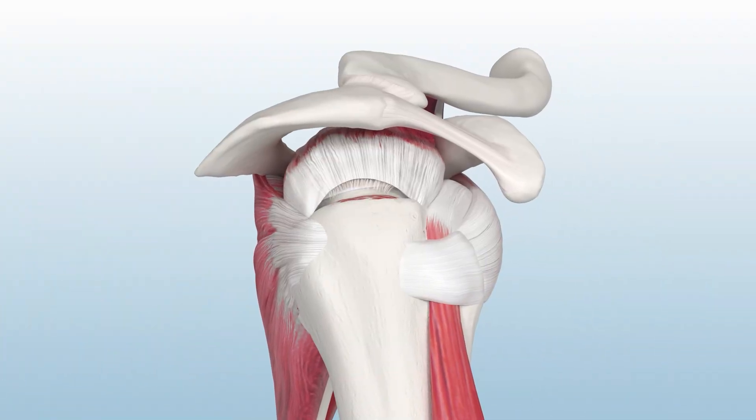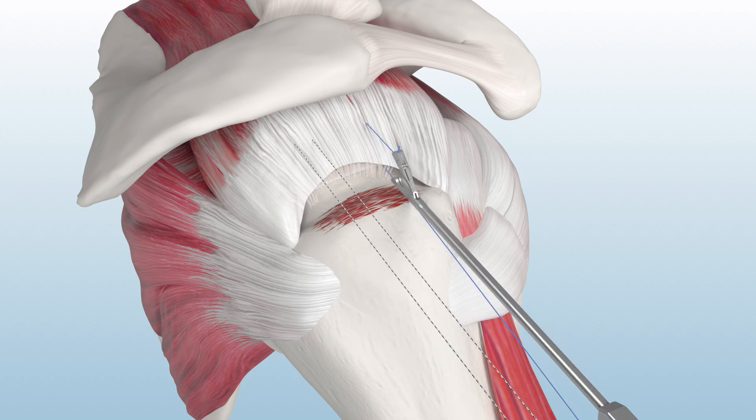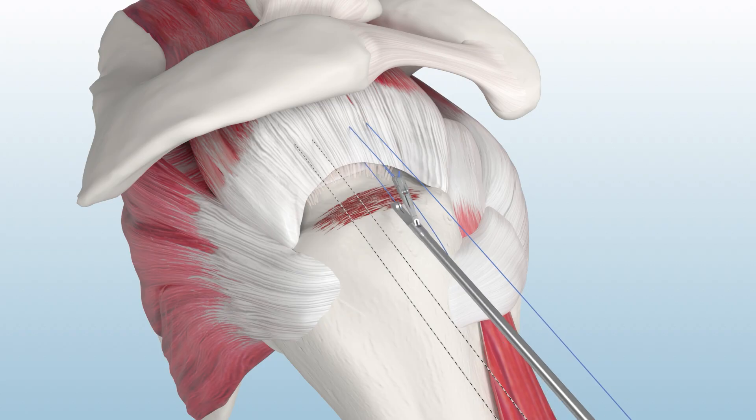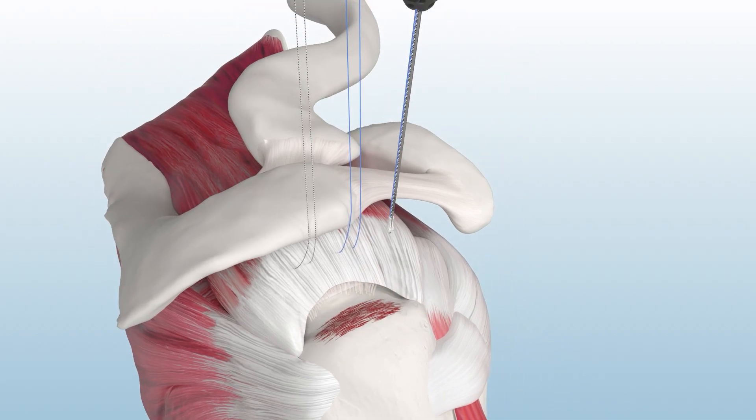To prepare for augmentation, place two mattress stitches in the medial aspect of the tendon using free suture. Once passed, dock all suture through an accessory portal.